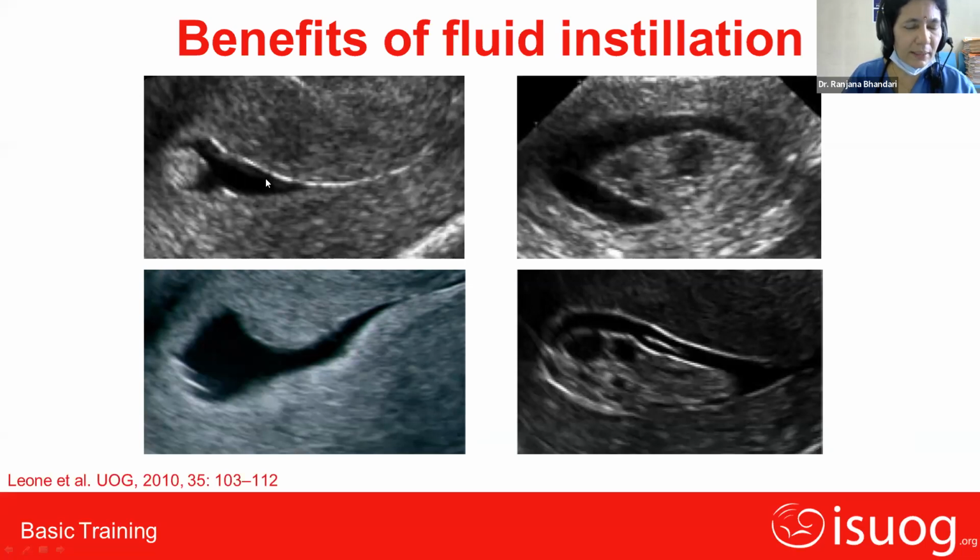This should be undertaken when we are confused about the endometrial pathology, whether it is something important, or something like endometrial hyperplasia, or a polyp, or a myomatous polyp and all.